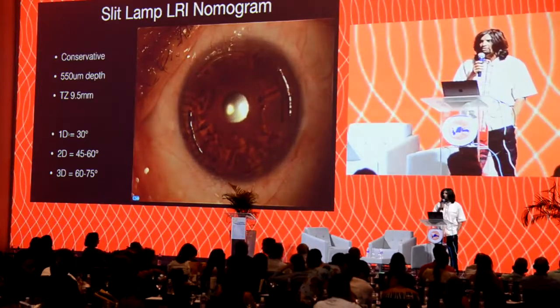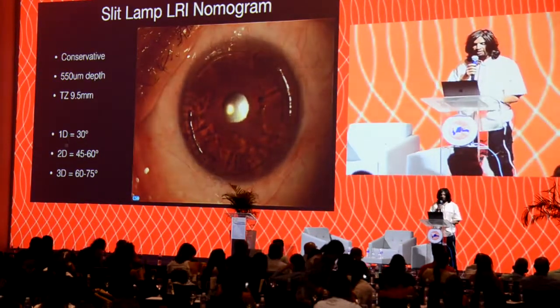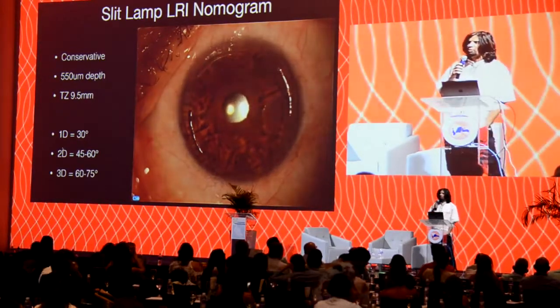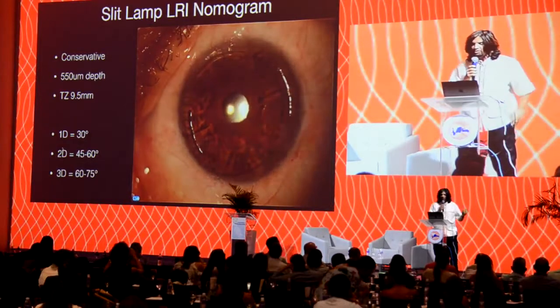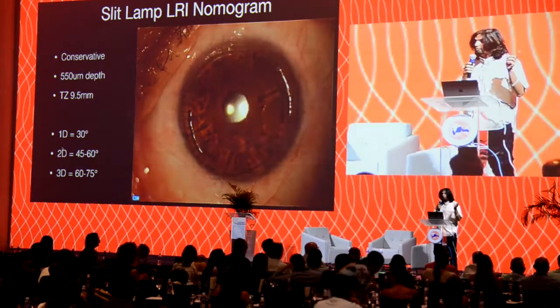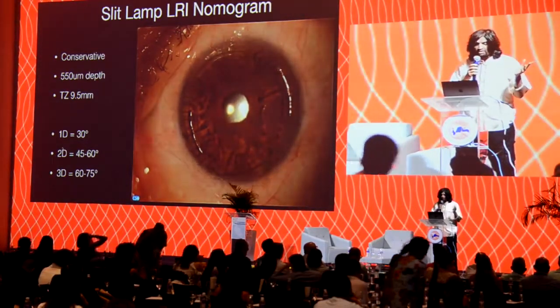Now, there's very much an art to this. It's very much based on wound healing. So these are general approximations. And once we get over a diopter and a half, I think it becomes more difficult to control how much we treat. These are arcuate incisions made at the slit lamp. We don't need to have a femto laser to do corneal relaxing incisions.